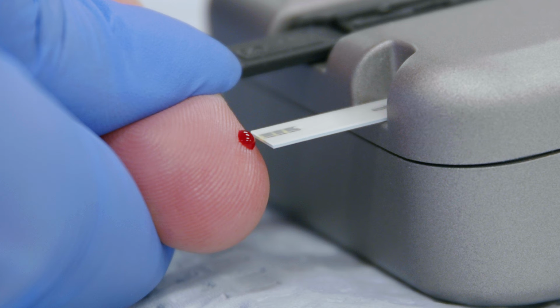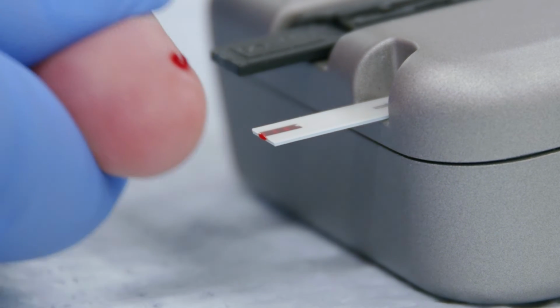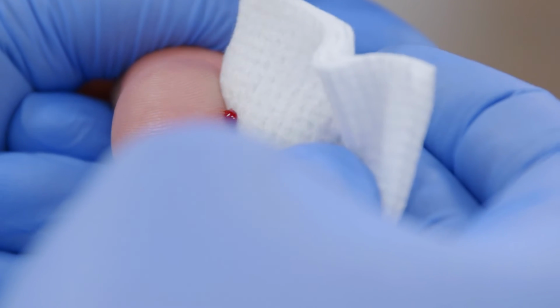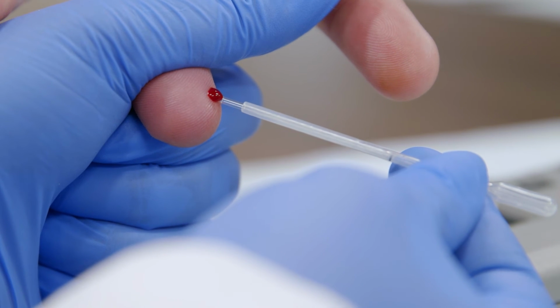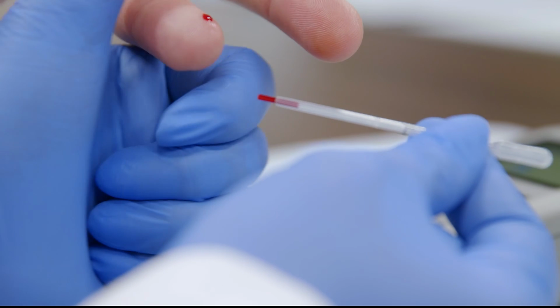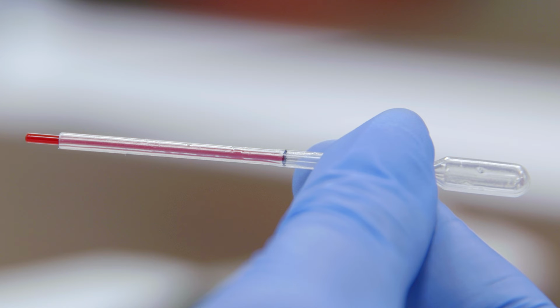Apply the sample to the eGLU test strip first. Touch the blood drop to the tip of the strip. Wipe away any blood remaining on the fingertip with gauze, and then collect a second blood sample for the lipid panel test strip with a capillary tube. The blood drop should be hanging down from the finger to make it easier to collect the sample with a pipette or capillary tube. Again, gently apply intermittent pressure to the finger until you've drawn the appropriate amount of blood.